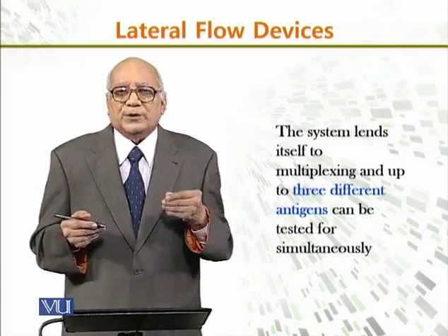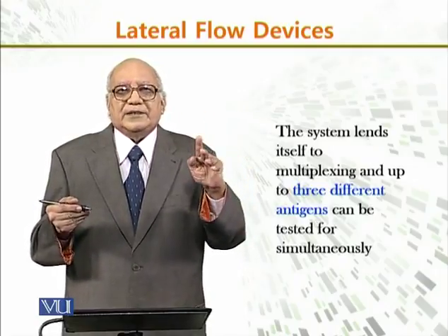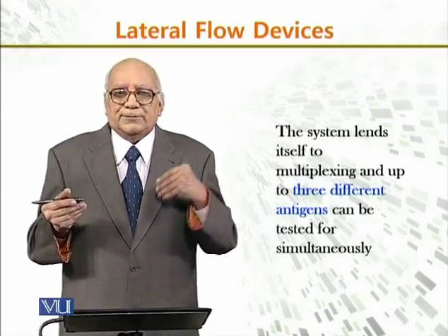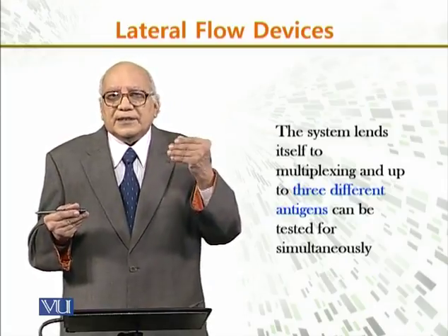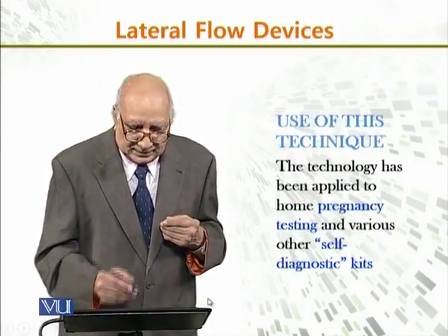We can multiplex 3 different types of antigens to analyze 3 different tests simultaneously, using different colors or different material.